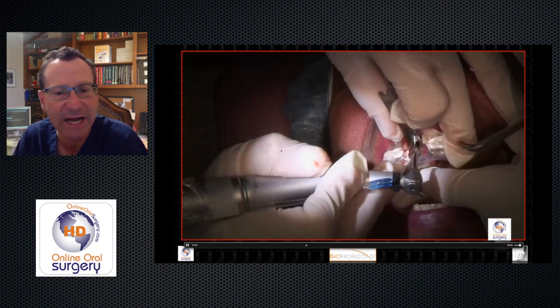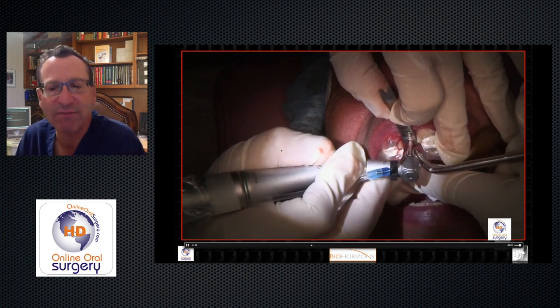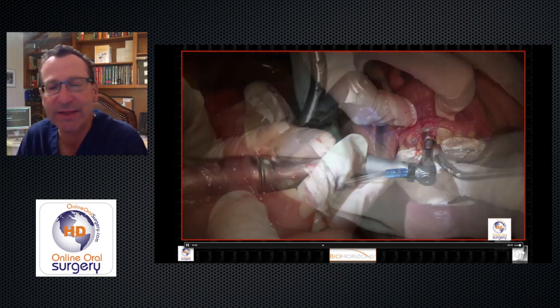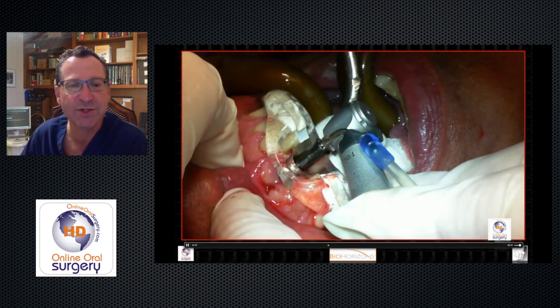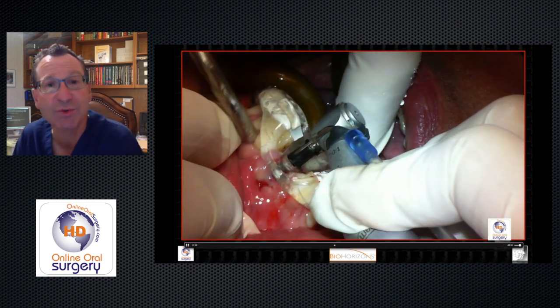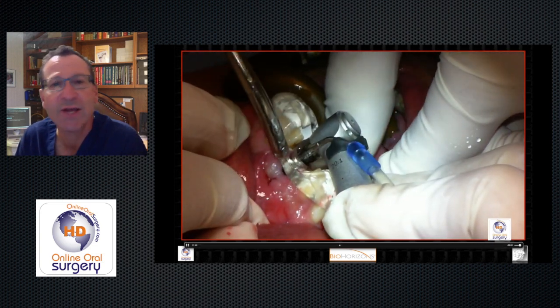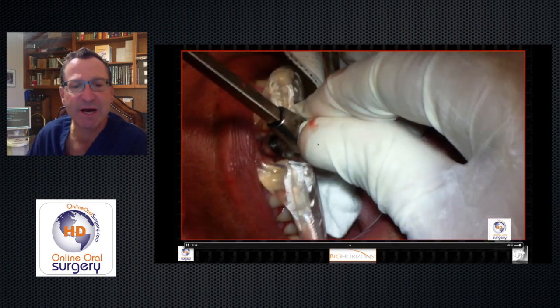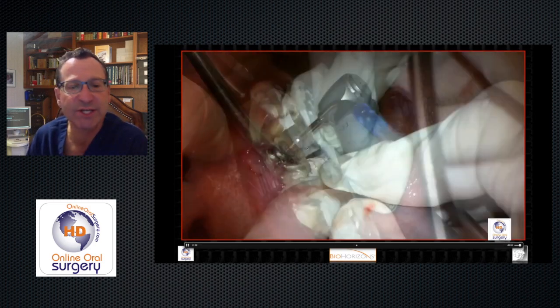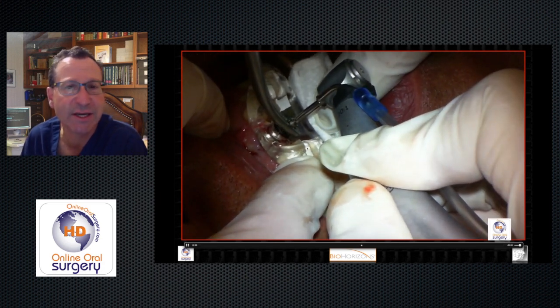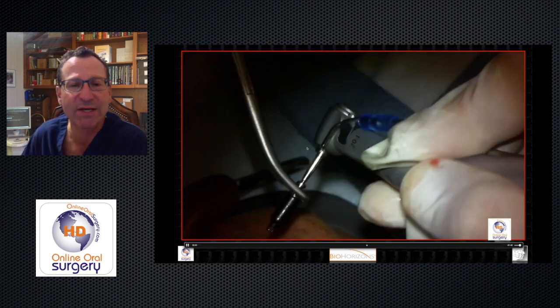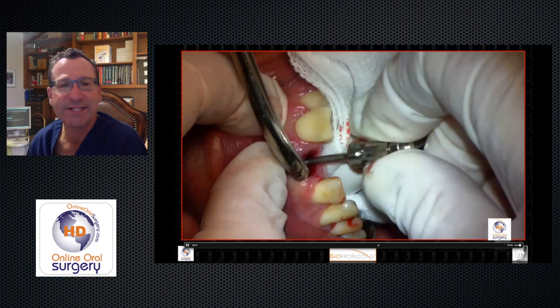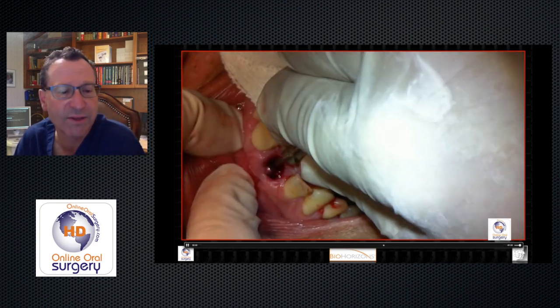We don't have to stop and take radiographs to make sure the drill is properly placed because we've done all the planning ahead of time — boom, boom, boom: first drill, second drill, third drill. For our final osteotomy, it's a 3.7-millimeter diameter osteotomy for a 4-millimeter implant. The implant goes through the surgical guide and attached to the implant is a guided mount that also goes through the surgical guide, controlling the position, angulation, and depth of placement. Generally I'll stop about a half-millimeter short of fully seated and complete the seating, adjusting the timing with a hand torque wrench.